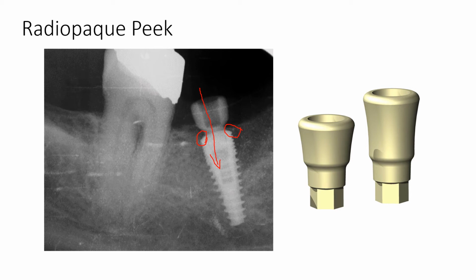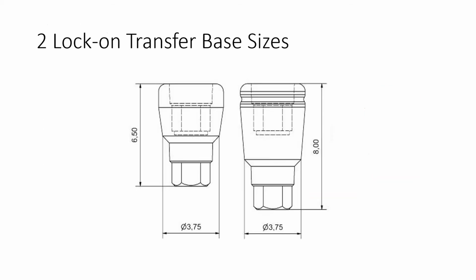So these components are very useful not only for transfer impressions and for soft tissue healing purposes, but they also eliminate the micro gap and help preserve our crestal bone.